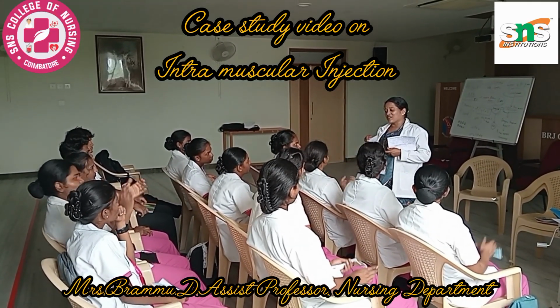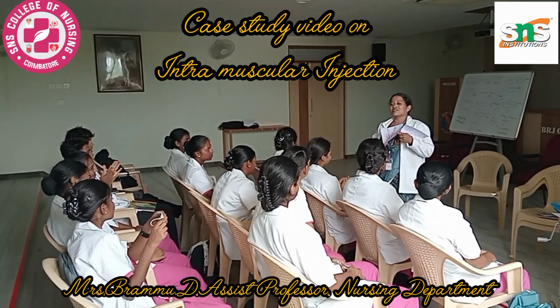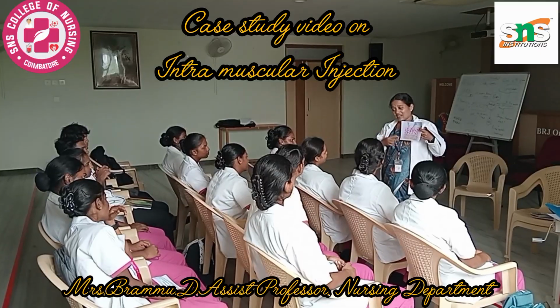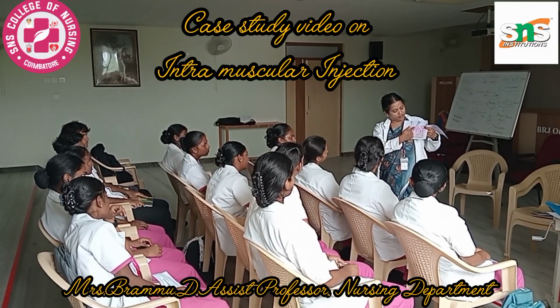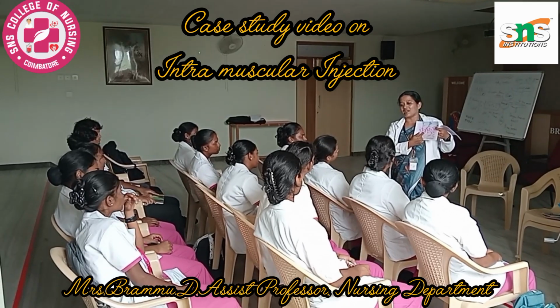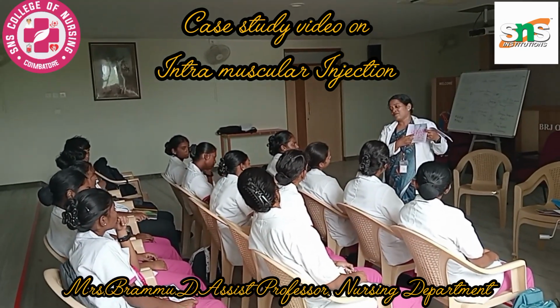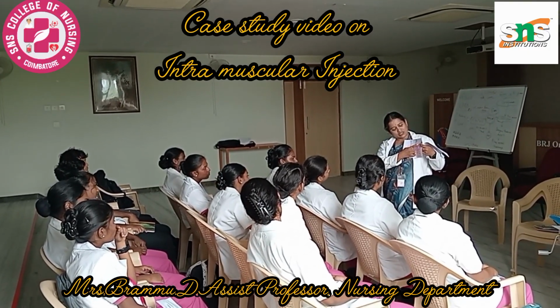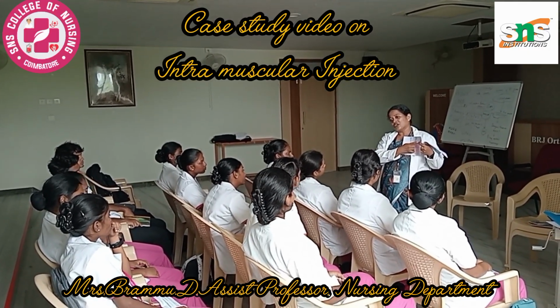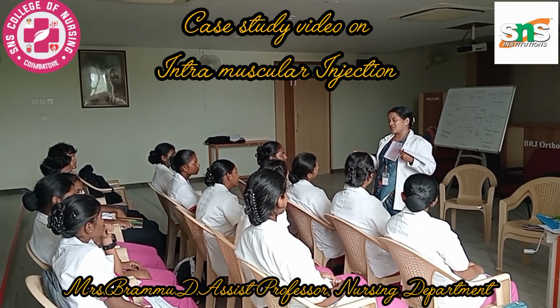Very good. Clap hands again for it. I think that she is studying daily. So 90 degrees, straight like a pen, you are going to insert the needle. The other, at a 45-degree angle, is only landing up, you can see the tip of the needle is landing only in the subcutaneous layer. The other one is sliding through the skin itself at a 15-degree angle, which is the dermal layer. Subcutaneous and dermal layers we will see later.